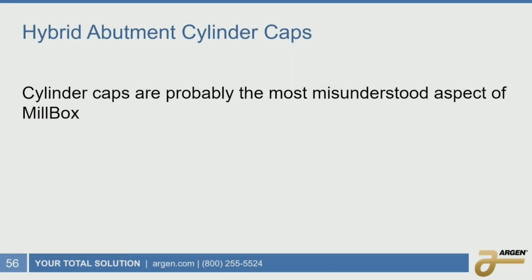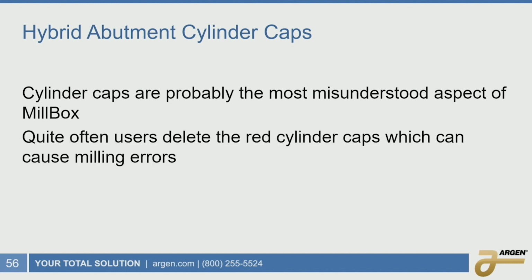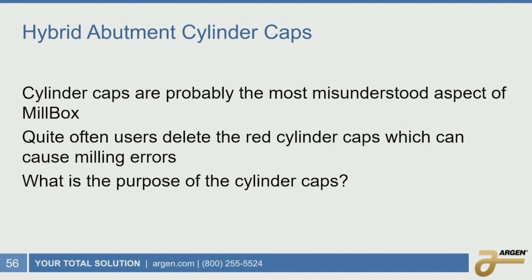Good old abutment cylinder caps. Right. So this is probably one of the biggest hot topics, at least over the last couple of years, is how to handle those red caps that are coming in on your screw-retained crowns and your screw-retained bridge work. And a lot of this is customers that are deleting the red caps or thinking that they need to because of previous versions of software or other CAM or CAD software out there. And the reason for that is we don't want to be doing this. This is causing more problems than most labs actually think.